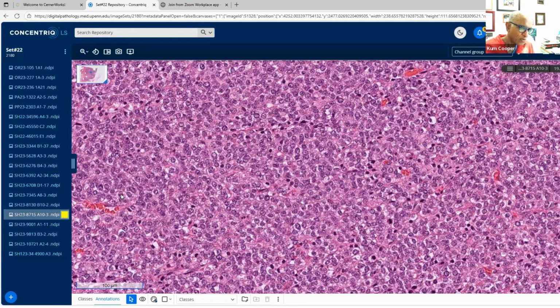And then, of course, if you have INI1, which I think is necessary in 2025 to make a diagnosis of epithelioid sarcoma, those are lost, SMARCB1. Let's see, I think I've covered everything that has been given. I like all your differential diagnoses. And then there's nodular hidradenoma. We addressed that with the spiroadenoma, with the epithelial markers being negative.